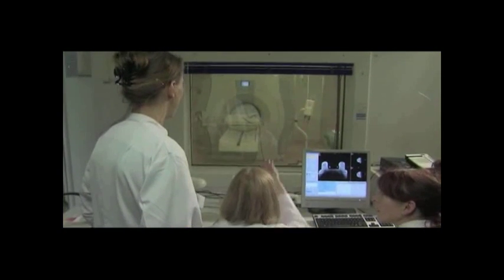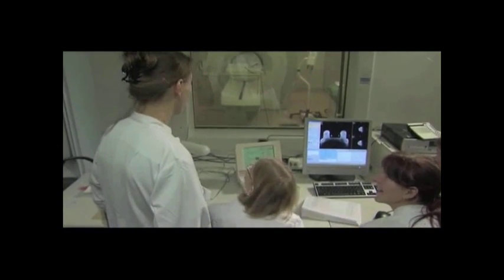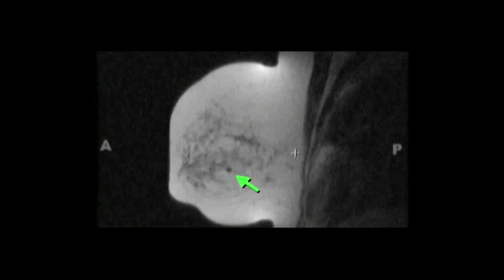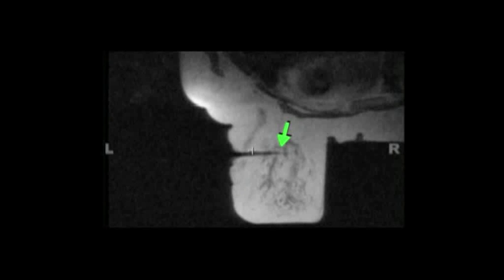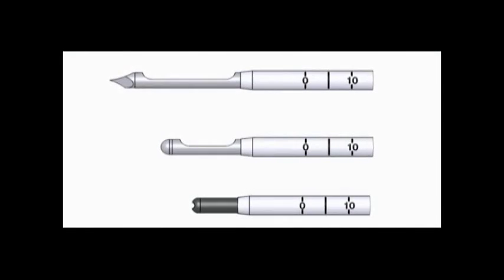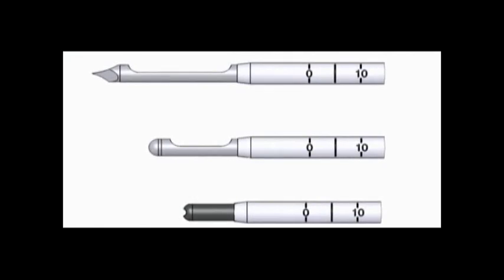Acquire images in the sagittal and axial views to verify target accuracy. The localizing obturator will project as a signal void, appearing as a black dot on the sagittal image and as a black line on the axial image. The tip of the obturator will coincide with the center of the aperture of the biopsy needle.